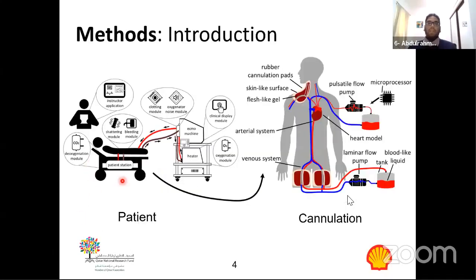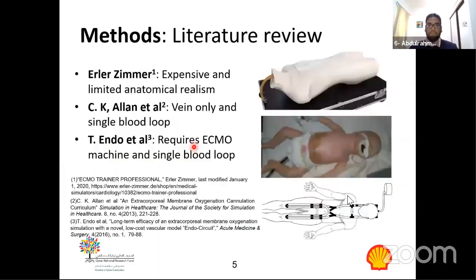First, our simulator is composed of multiple parts. There's the patient part, which is the cannulation simulator, what we're working on and what is the scope of this exact project. There is also the ECMO machine, which simulates the ECMO machine itself, and there's simulating the heater in order to create this full system.